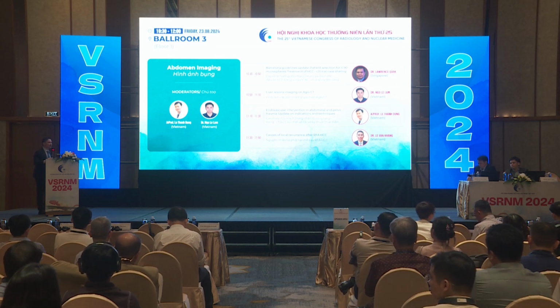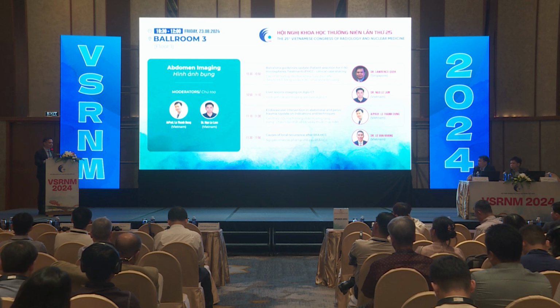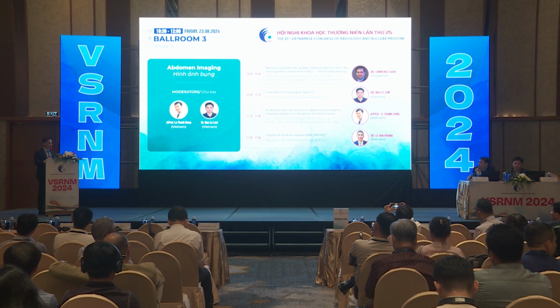Yes, so this is hepatic venous deprivation. When you do portal vein embolization on the conventional basis, you look at liver growth within 2 to 4 weeks. The surgeons are very keen to get operating quickly after portal vein embolization. Embolizing the hepatic veins with hepatic venous deprivation helps encourage growth of the liver remnant in the left lobe a lot faster. We've done a few patients, but our results haven't been that stellar.